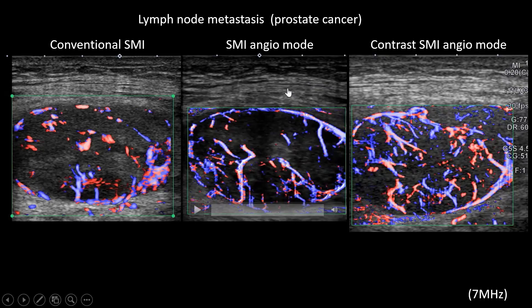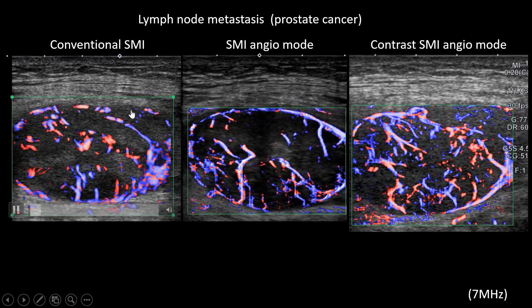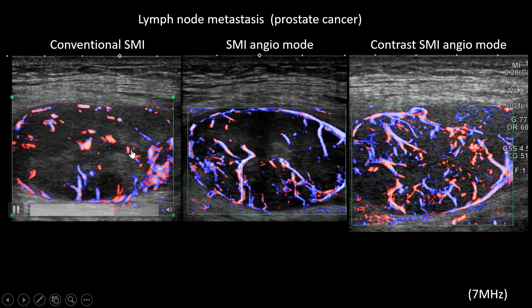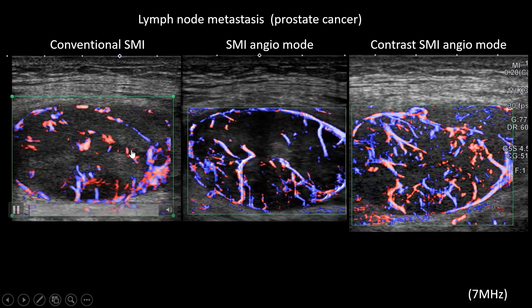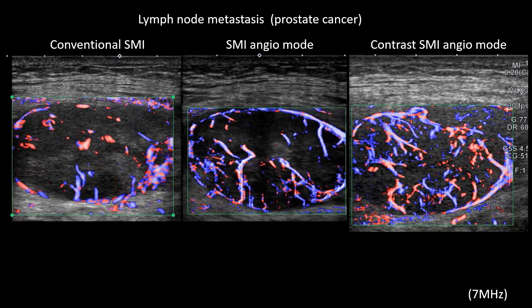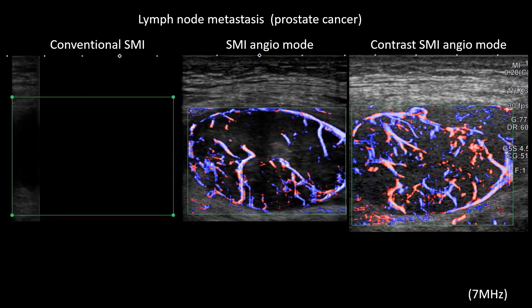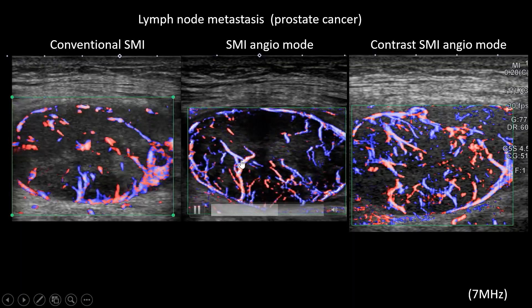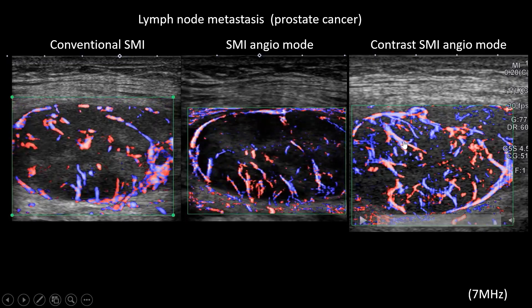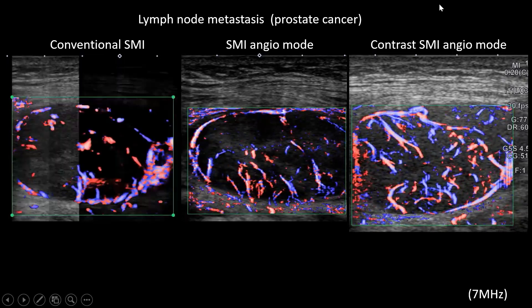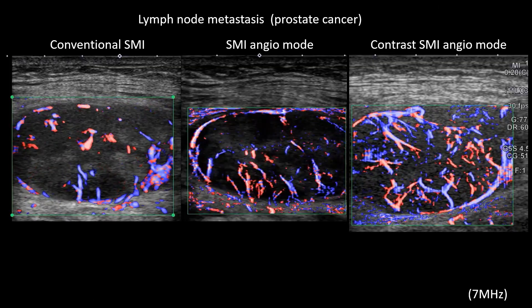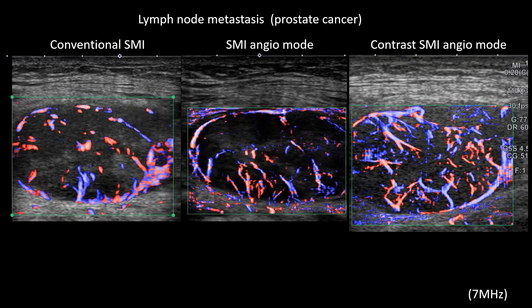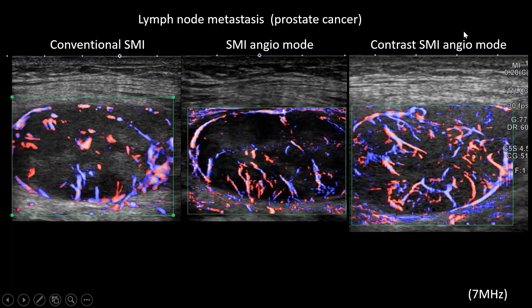This shows a metastatic lymph node swelling from prostate cancer. Conventional SMI shows a small vascular structure where the hilus of the lymph node is distorted, suggesting malignant lymph node metastasis. SMI Angio Mode shows even more vessels in detail. After contrast ultrasound, you can also switch to contrast SMI Angio Mode, which shows more vessels clearly.